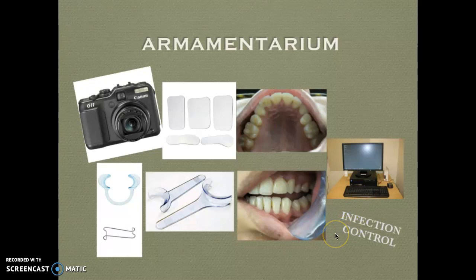Remember that we still are going to practice infection control protocols, that you don't want to handle the patient's mouth and then touch the camera, because you cannot sterilize this camera, nor can you really disinfect it properly. So when you look at the technique in the video, you can see that either the patient's going to assist you, or when you get really good, you can handle the camera with one hand and then direct the patient with the retractors with the other hand.